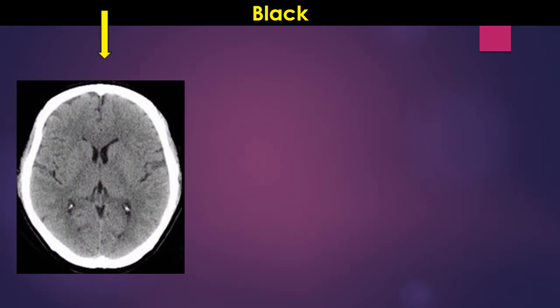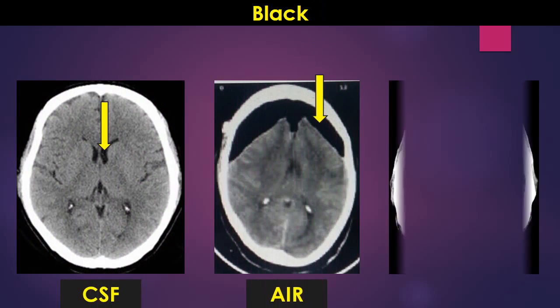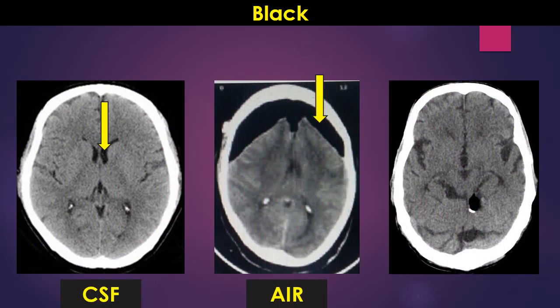Tissues which are seen black on CT brain are CSF, air, and fat which in this case is lipoma.